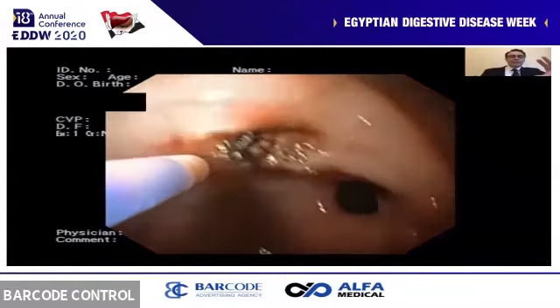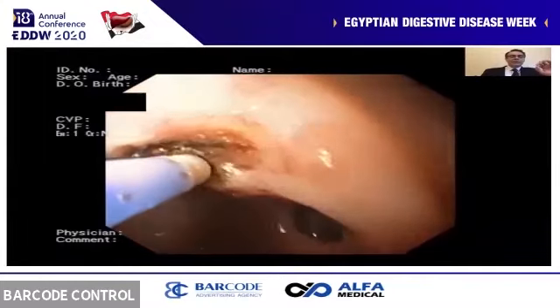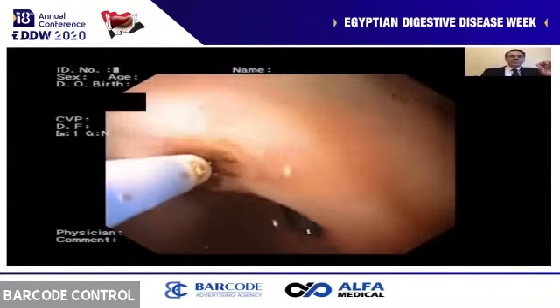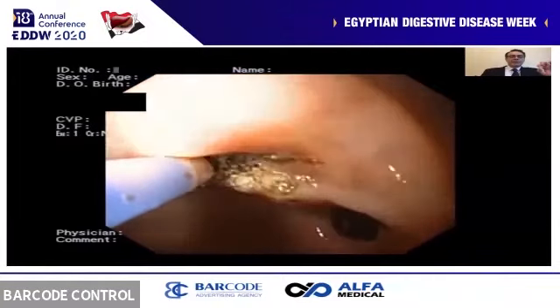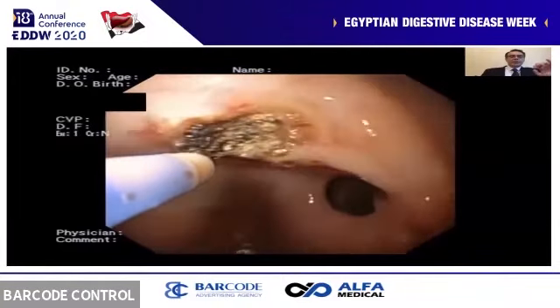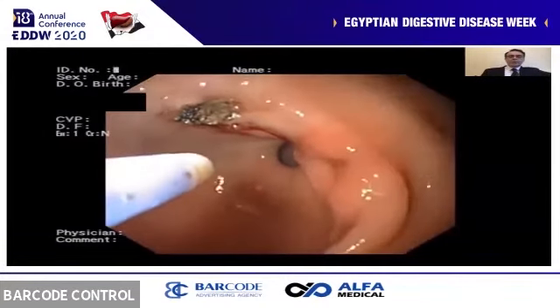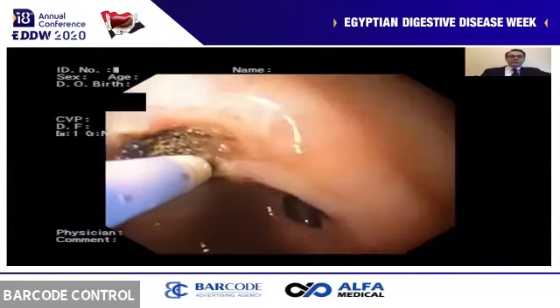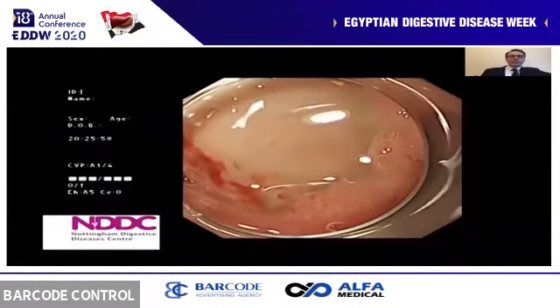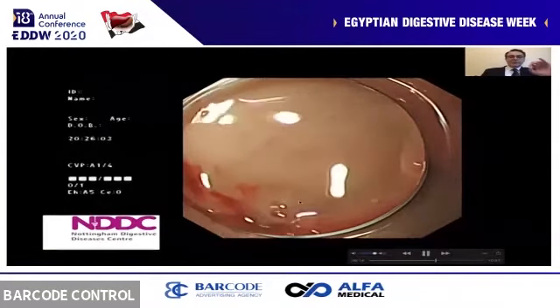Now we managed to treat the vessel, and now we're much more confident that hemostasis will be achieved and that the risk of rebleeding will decrease. And there were more ulcers, and this resulted in permanent hemostasis. Here we can see this visible vessel, which is pulsating.